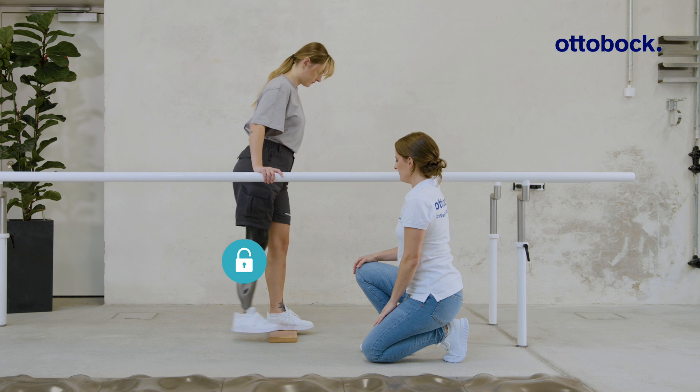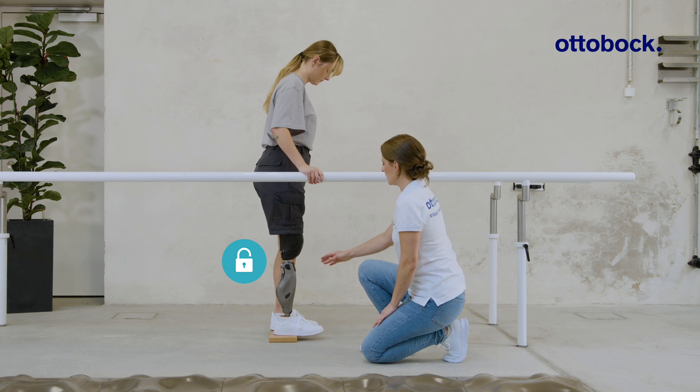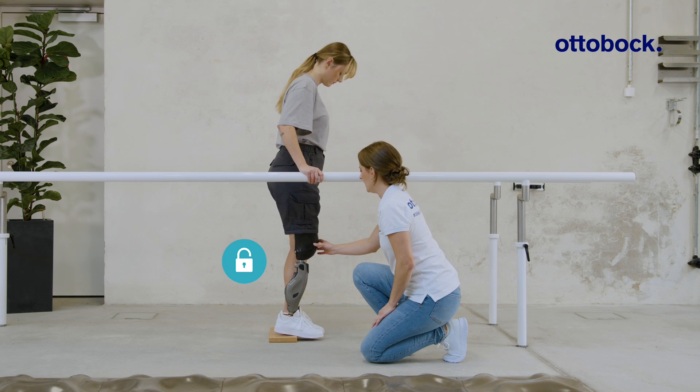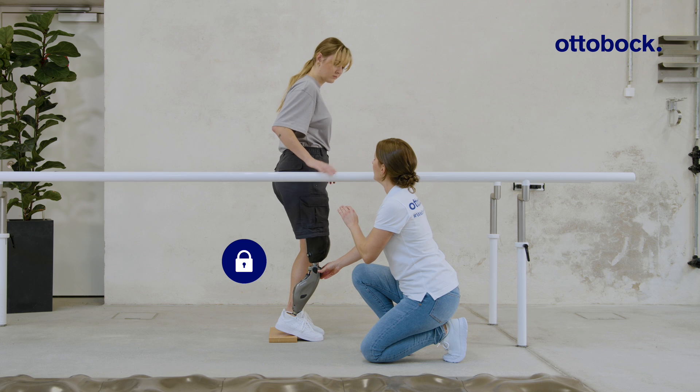The stance function allows the user to stand in a relaxed position, support standing on slopes, and relieves the contralateral side. The knee joint blocks against flexion when it is slightly flexed, loaded, and not moving.